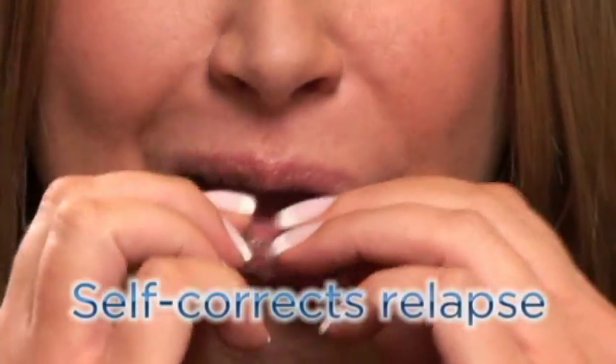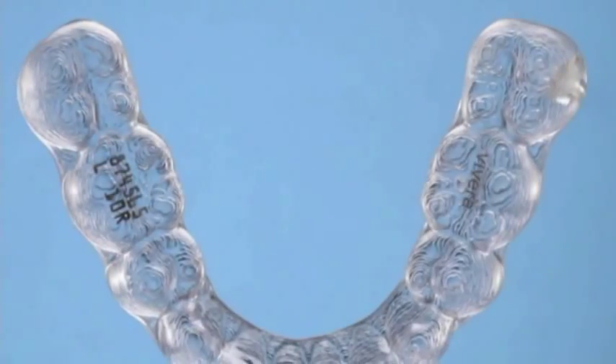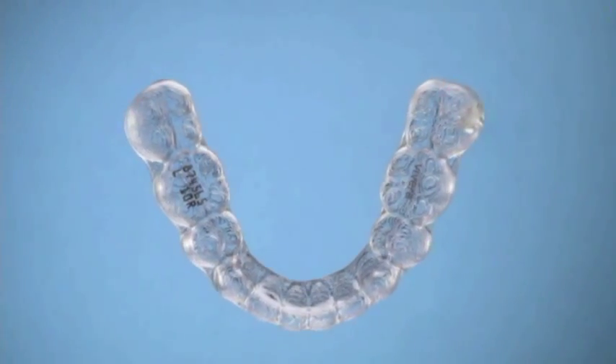The superior strength of Vivera retainers enables them to self-correct back to the final retained position certain types of relapse that may occur during the subscription period, up to 0.25 millimeters per tooth.